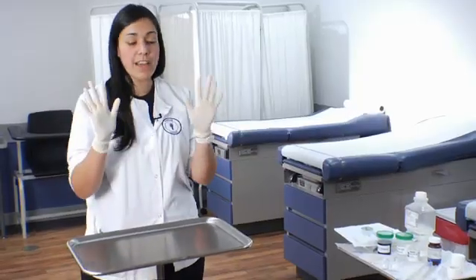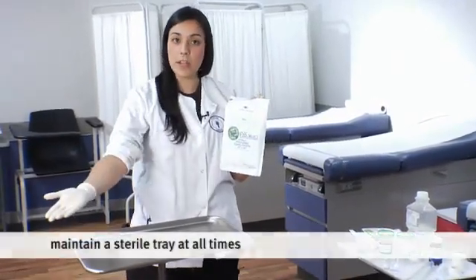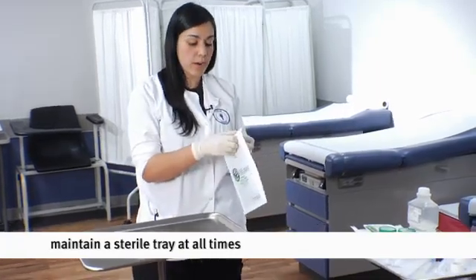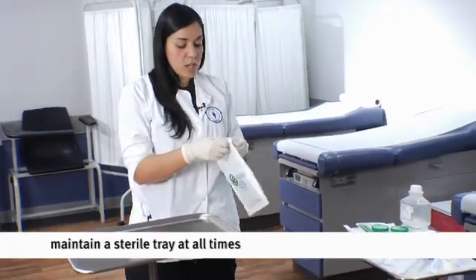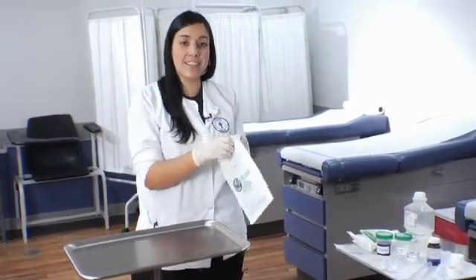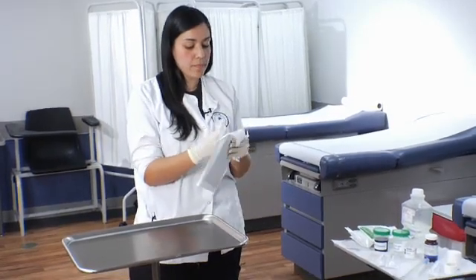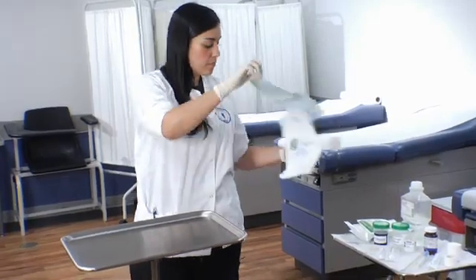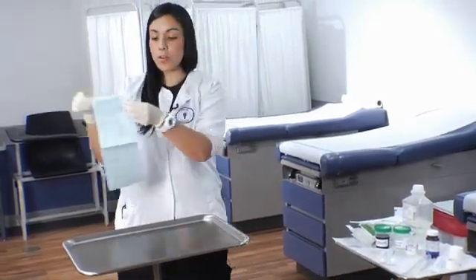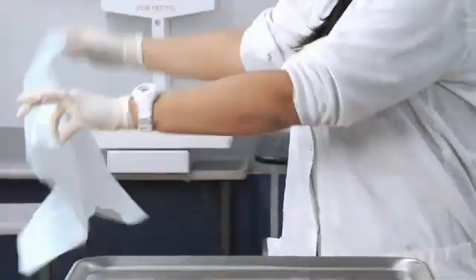I already have my gloves on. Make sure that before you put your gloves on you have already washed your hands. The first thing I'm going to do is grab my sterile field. I'm going to go ahead and lay out a drape here that has to maintain sterile — very important. When you open this, you want to be very careful because you can only touch the corners. You want to really maintain the integrity of that field. Go ahead and open it up — you'll notice the corners show you where you're able to touch. Spread this out.